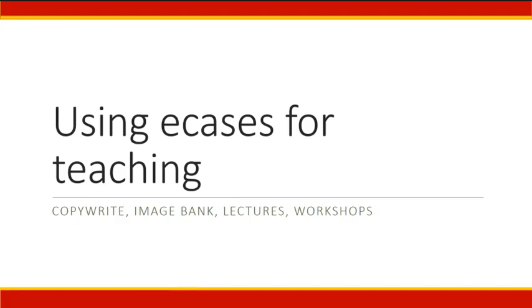How many fellows in the room who teach registrars with lectures or glass slide workshops? Well, this is for you and me.